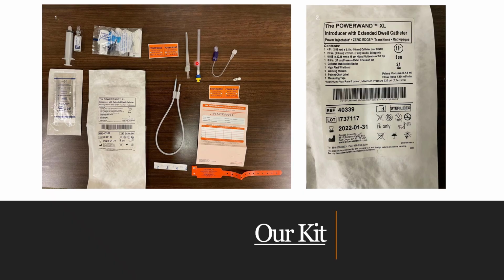It's actually got the dilator within the catheter lumen itself. We'll see how a trimmable catheter looks in the next image. Just to go through some other things you need to add, it does not necessarily come with lidocaine and a flush. You may need to get some stuff for your ultrasound, like a sterile probe cover. Still need gloves, gown, drape, all those sorts of things, cap.